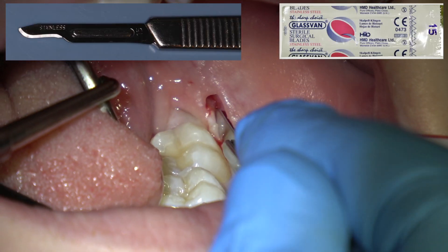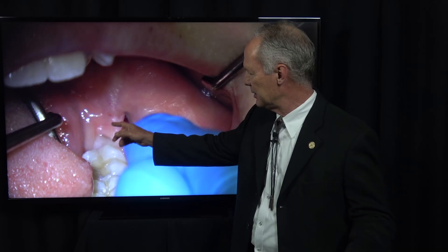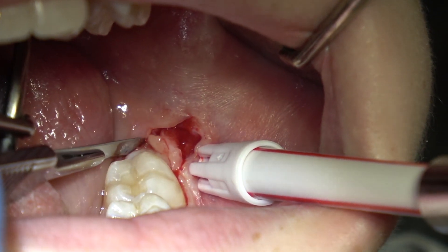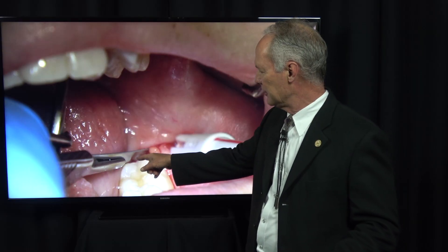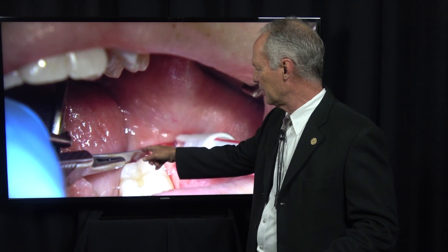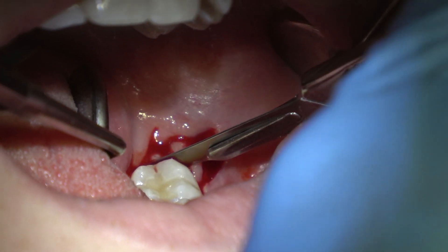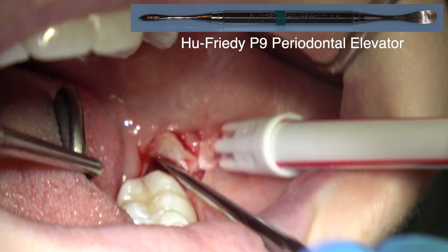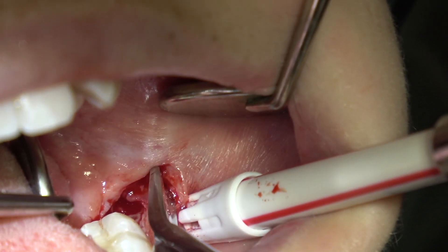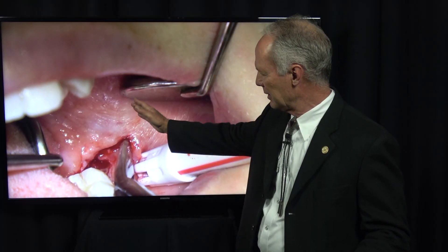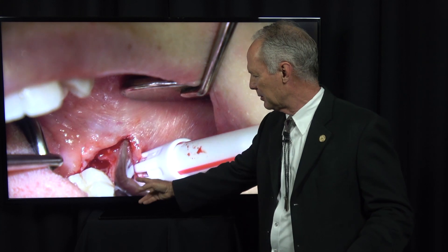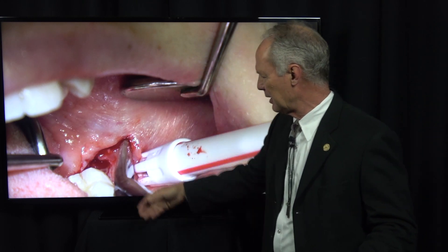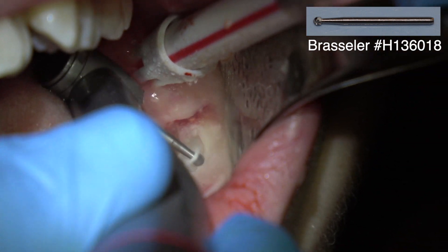I'm cutting a distal wedge here. You cut the distal wedge so you can take that tissue out, have access to the tooth, and approximate the flaps better. You're cutting from the distal buccal of the second molar to the distal lingual of the second molar back to a point, then cutting straight across the tissue distal to the second molar. Then with a periodontal elevator, I'm removing that distal wedge and elevating the flap with my periodontal elevator and surgical scissors, cutting the periosteum so I can reflect the flap.